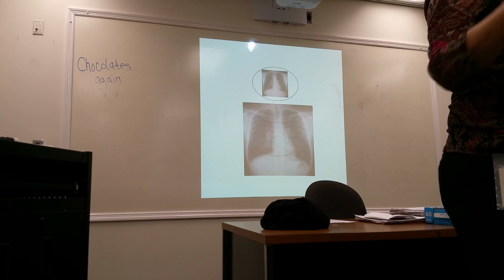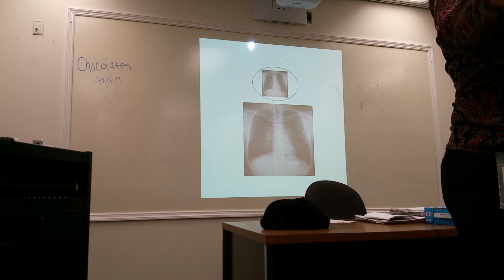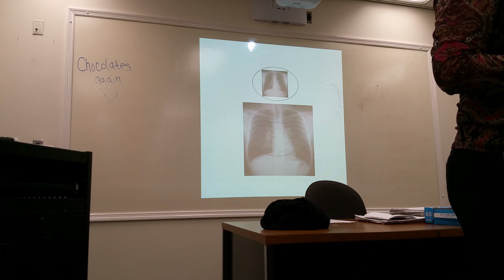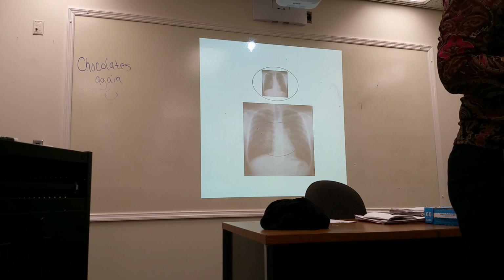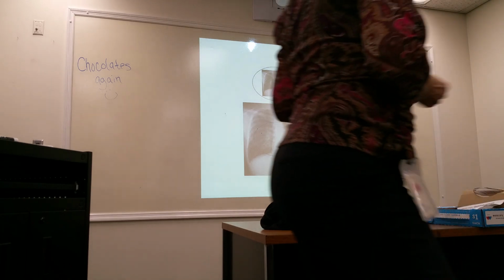Fluoro in normal mode, an area of interest comes up, go into mag mode, take some static images of it, and then go back to normal. That is how it should work. Have you seen any of your doctors fluoro in the mag mode the whole time? The whole time. Okay, so just something to think about.